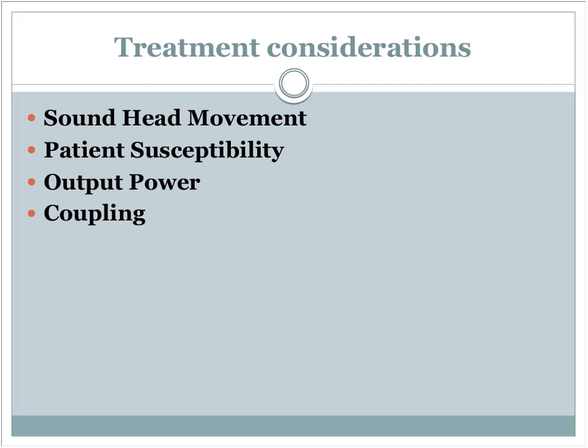You have to look at the patient's susceptibility. Some people seem to be more sensitive to ultrasound. I've heard it from patients in the past where they've said, oh, I feel that. That feels weird. And I think, all right, they're crazy because you can't feel ultrasound, but you can. And it's interesting that some people just are more sensitive to it. So pay attention to that, understand that they may be feeling it.